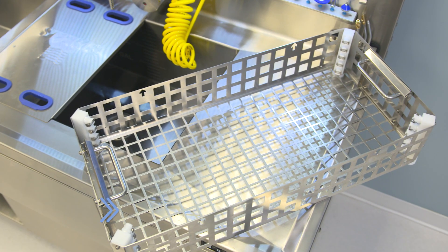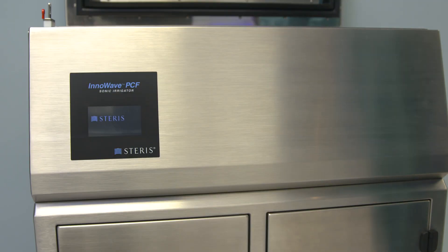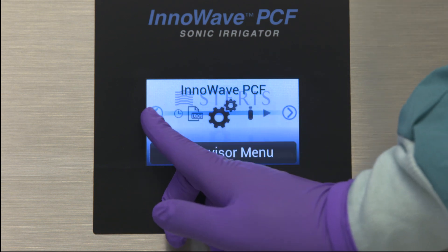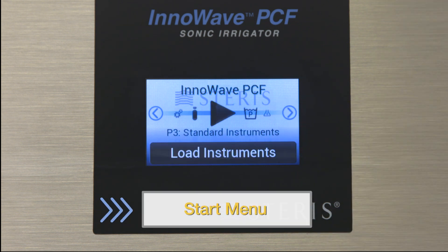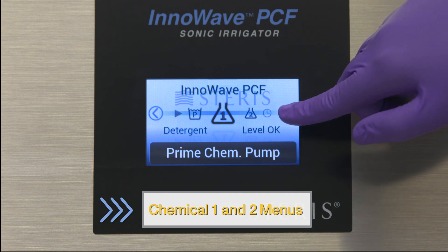Let's start by reviewing the main components. Your InnaWave PCF comes with a standard basket, one set of instrument tubing, and an assortment of distal connectors for flushing. Use the touch screen to operate your ultrasonic irrigator. The icons help you perform various functions. Use the right and left arrow keys to scroll through the control screen. Use the start menu to begin an automated cycle sequence, and the wash menu to select the correct cycle from the list of pre-programmed and custom cycles. Use the chemical menus to prime each chemistry pump — we will cover priming the pumps later.